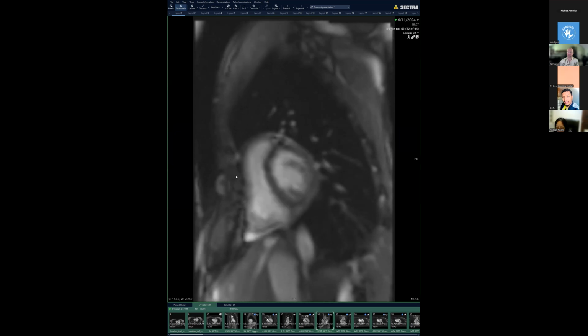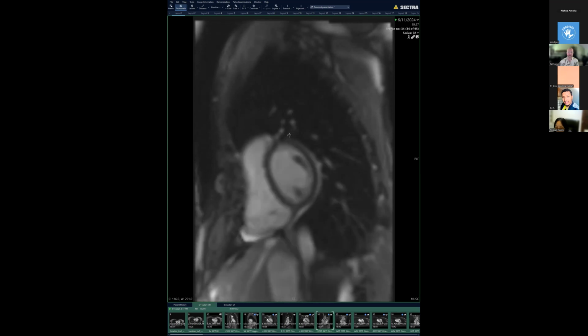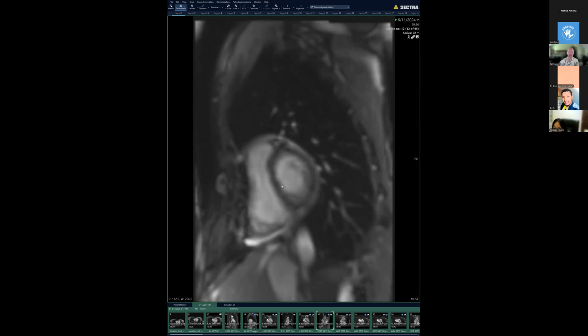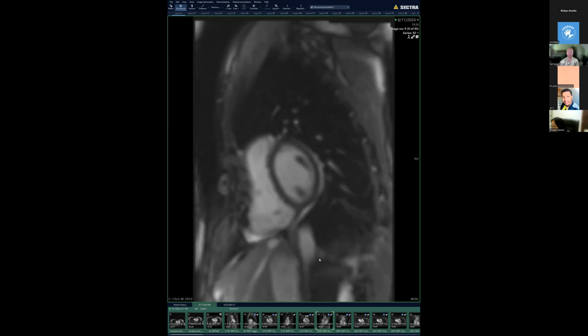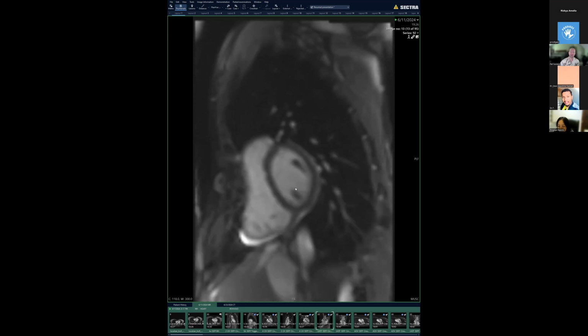Here you can see that this anterior chest wall is impressing on the right ventricle. And as we're asking the patient to take a deep breath, which is the test of choice, you can actually see that you do have a little septal flattening transiently during deep inspiration. So during normal rest, you have a nice donut of the left ventricle, both in the diastolic and the systolic phases. But as soon as the patient's diaphragm starts to move downwards, you will see that right there, there's a little flattening of the septum. Which means that the filling pressures all of a sudden in the right heart exceed that of the left heart, just momentarily.